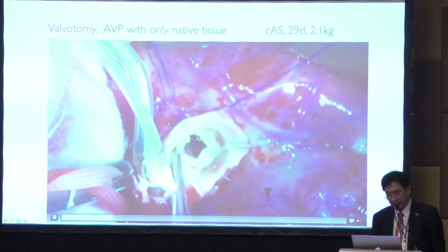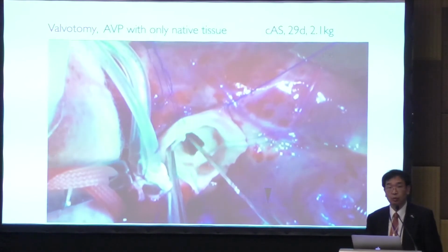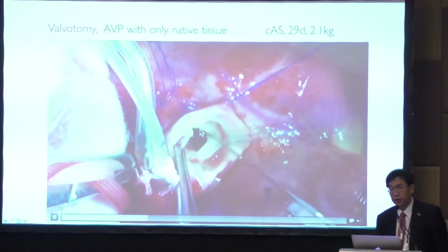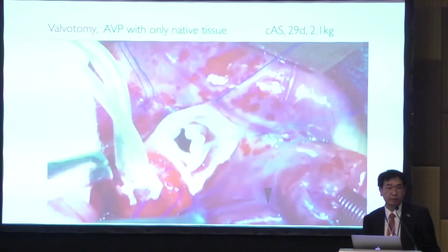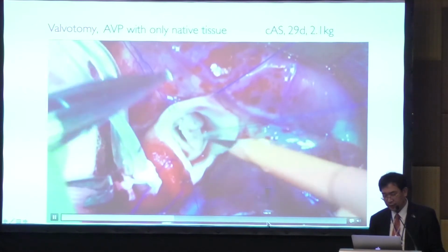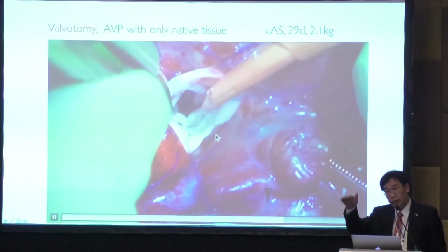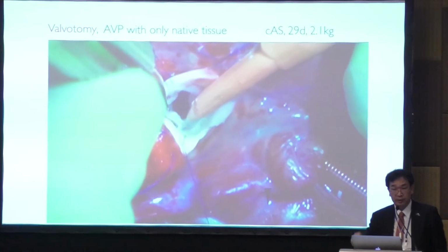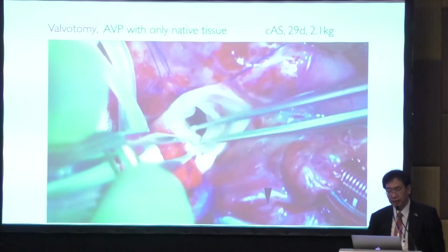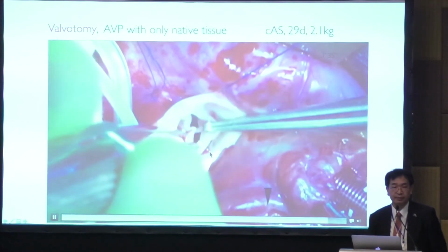Commissure, the better side, the better coaptation height side. We can do commissurotomy to the wall. And maybe this commissure will not have a regurgitation because of the acceptable coaptation height. However, on another side, you can see this side, the coaptation height is lower, smaller than the other. So I was afraid of making a regurgitation, so 0.5 to 1 millimeter before, I stopped the commissurotomy.